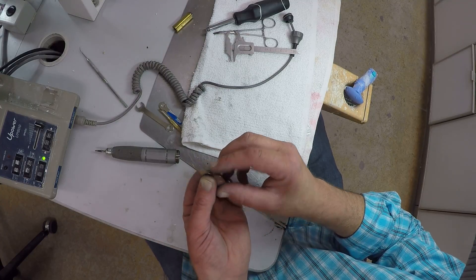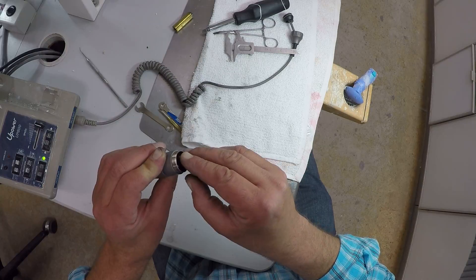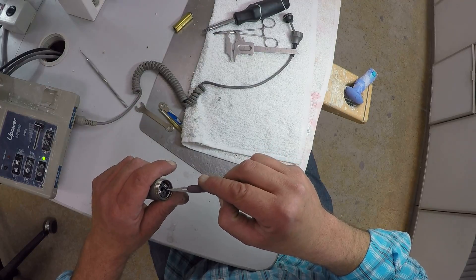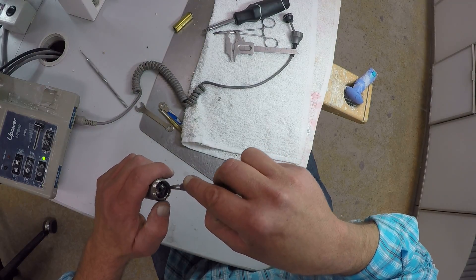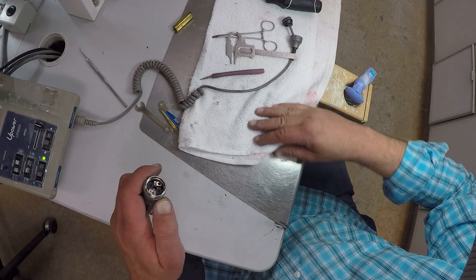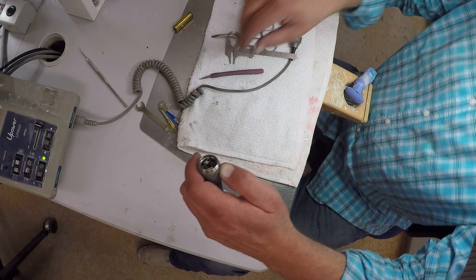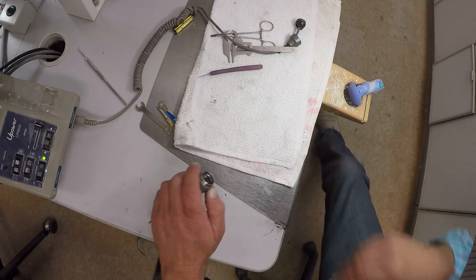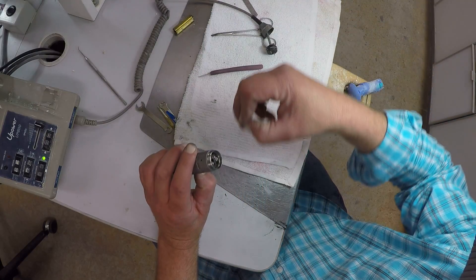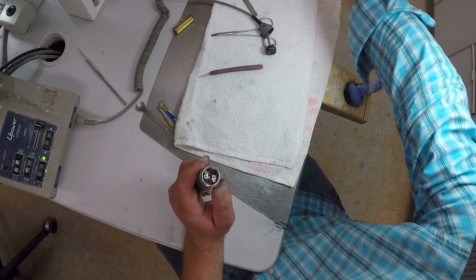Now we've got it in — see, it's kind of loose like that. Push it back in here into place and I'm just going to screw it all back together. It's pretty easy. This would normally cost probably $120 to have a repair done, but we can just do it at home or at the lab. We've got lots of screws — these things are pretty small and hard to spot, so best to keep an eye on them.